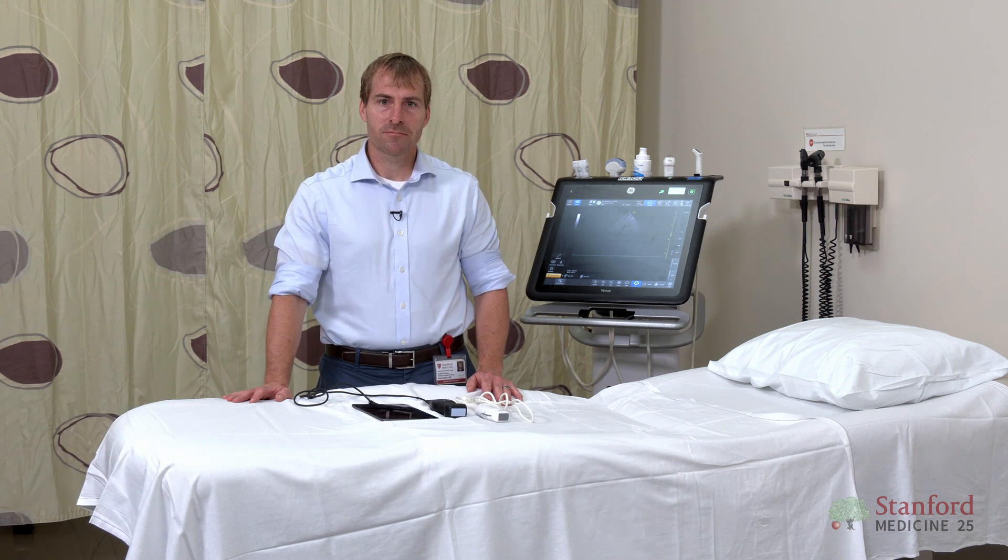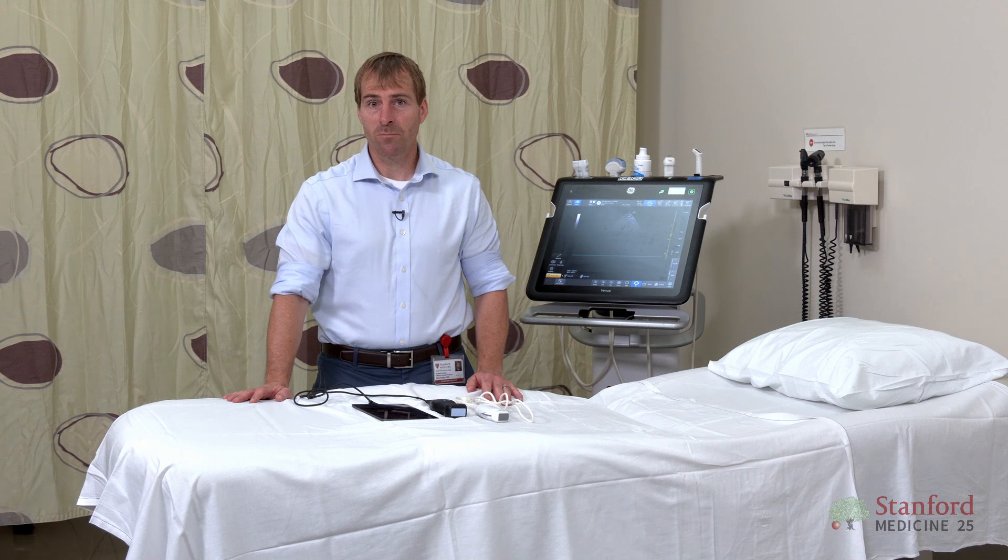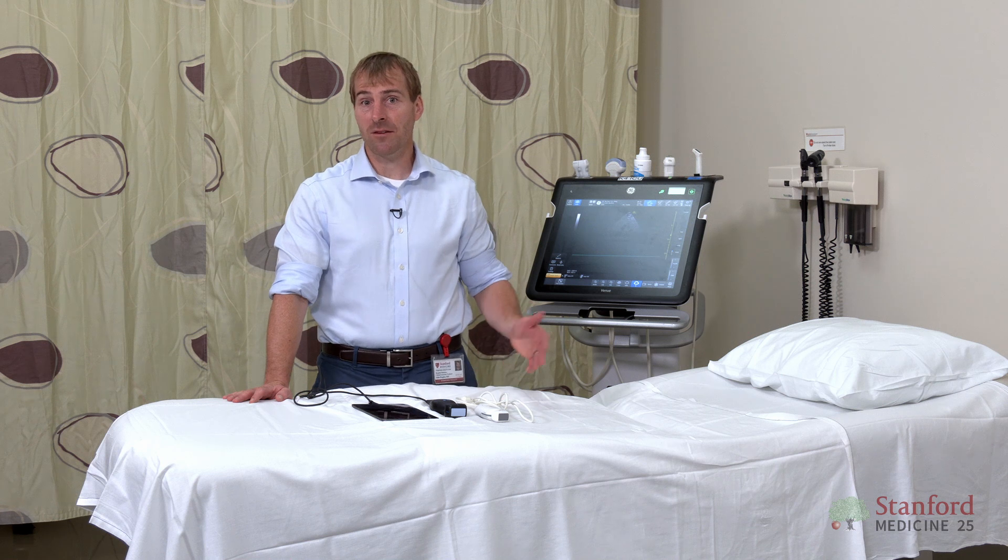I get asked a lot what machine you should get when you're trying to start your ultrasound journey. It's really important to consider a few things: first, how are you going to use it? What kind of setting do you work in? How much money do you have to spend? And then finally, what's your IT infrastructure?